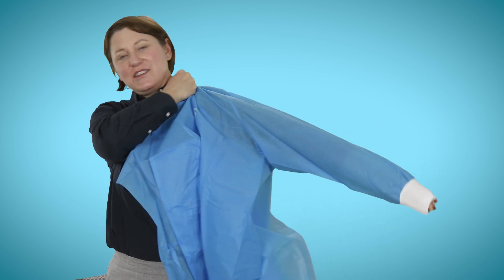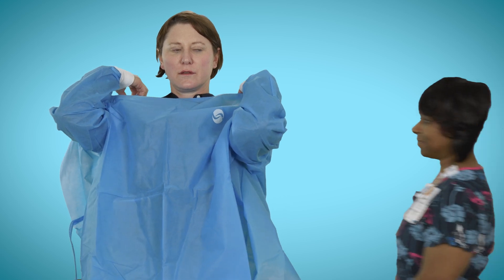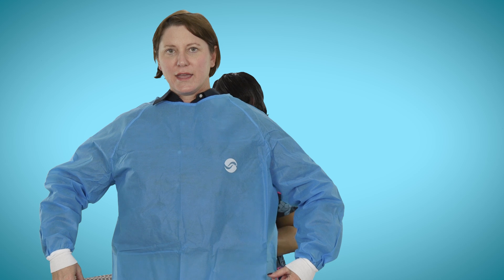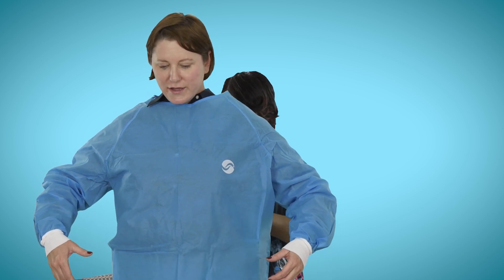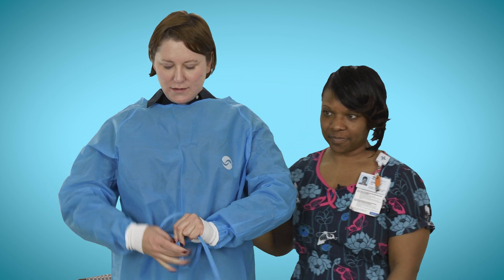The next step is putting on a gown. The gown will go on front to back. Make sure that you cover your sleeves — don't pull your cuffs up, leave those over your hands. You'll need someone to help you secure the gown, and you'll go ahead and secure it around to the front using the ties, making sure that the folds are out and that you're completely covered.